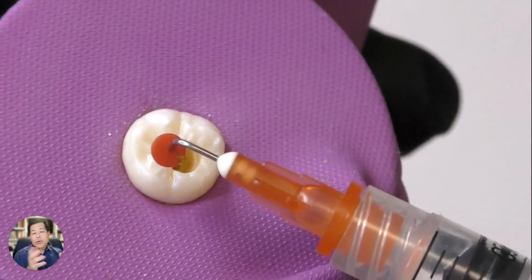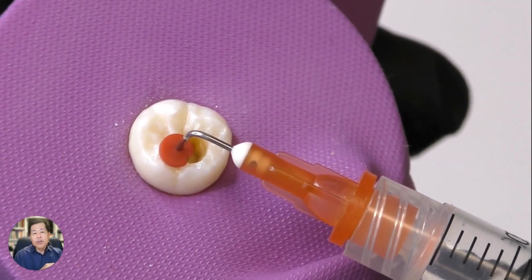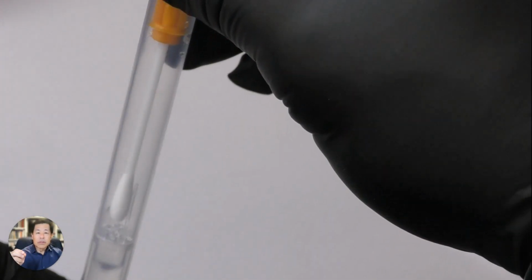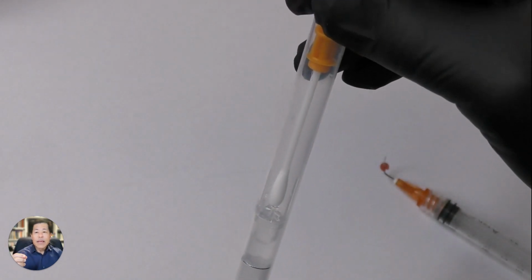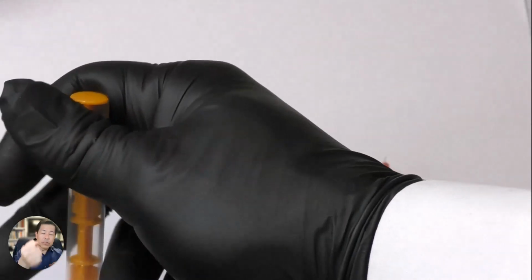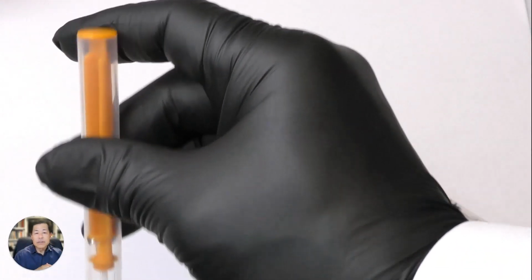When we're doing our root canal, we irrigate with sterile water in the canals. Then we take a sample of that aspirated fluid, we put it on our cotton swab, and then we depress the swab stick until we push the cotton swab into our reagents.